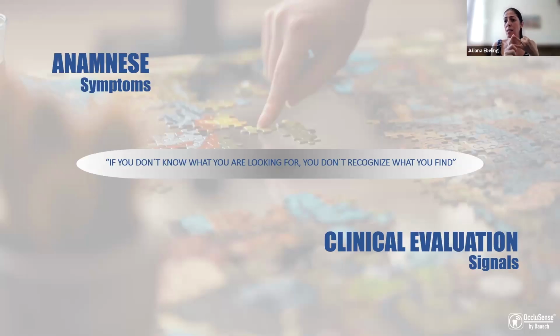Cracks, sensitivities, cervical lesions, non-carious cervical lesions, diastemas, movement of teeth after orthodontic treatments. All these signs are telling us that this system may be in an unbalanced activity.